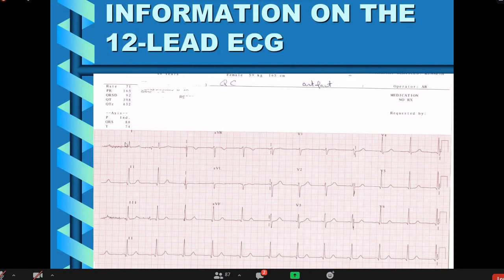But the important thing in this, you can see these vibrations. What is this? This is not cardiac arrhythmia. If you compare this lead to the others, there's nothing, so this is basically artifact. And people, if they don't recognize it, can just say it's ventricular fibrillation or something is happening. So be very careful about labeling any ECG, unless you are confirmed by yourself or by a senior.